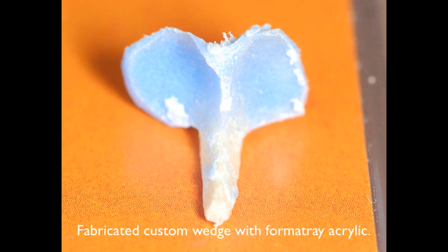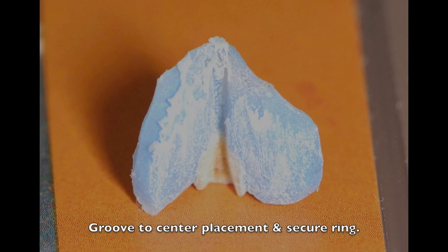So the next logical step was to develop some prototypes. This was accomplished by placing a wooden sycamore wedge between some teeth, and then laying formatory acrylic on top of it. As you can see, it's adapted to the tooth structure very well. To help line up and center the rings, a little groove was placed along the back. This groove also prevents the rings from dislodging or popping out of the mouth.